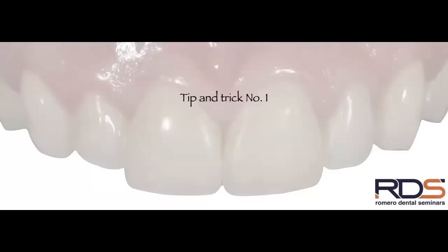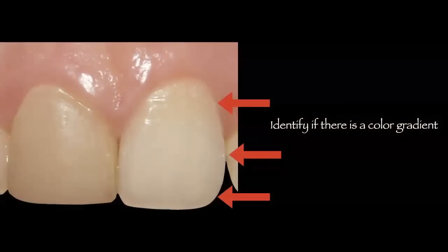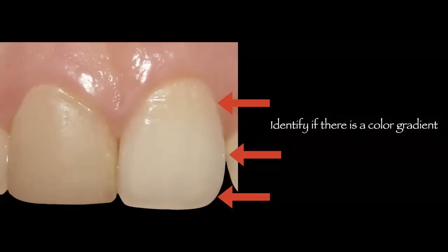So let's get into our tip and trick number 1. The first thing that I want you to know when we're trying to deliver direct composite veneers for our patients, the first thing that I would highly recommend is to identify if there is a color gradient on the natural tooth or teeth surrounding the area that you want to restore. As you can see in this photo, where I'm going to restore tooth number 8, I am visually inspecting tooth number 9 because that is the tooth that I need to match.